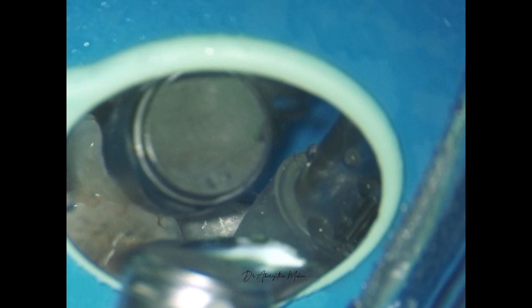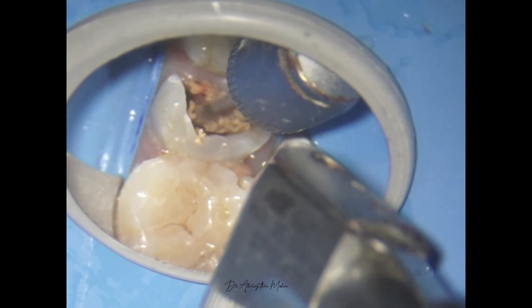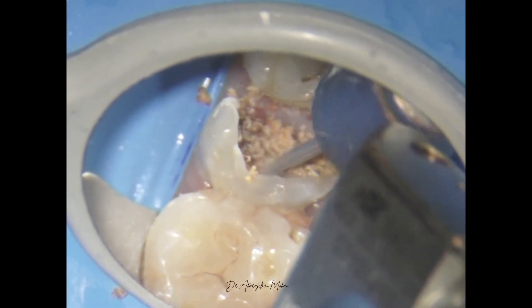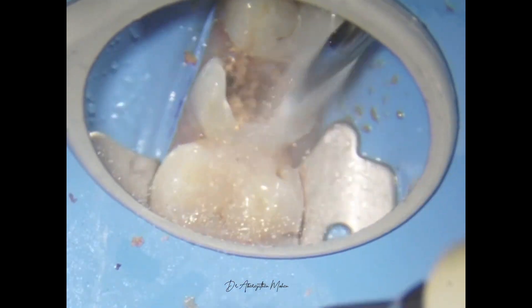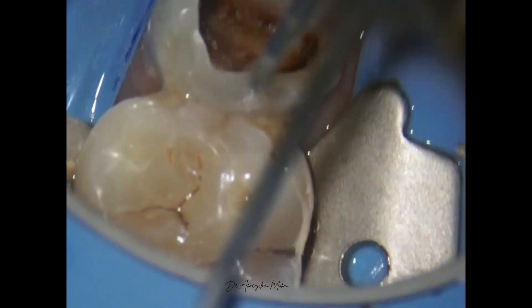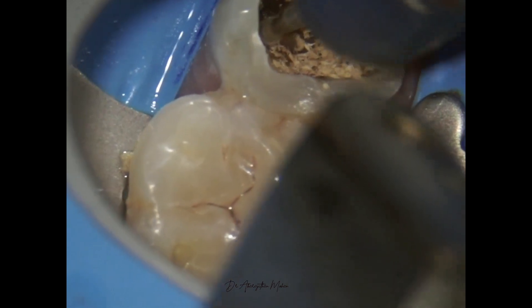I need to cut with much more control, so I will stop using the airotor high speed bur here as it is completely blocking my vision. You can see the use of long neck burs here — since the shaft is long, it does not obstruct my vision. Since it's used in slow speed, the speed range is between 5,000 to 20,000 RPM depending on what control you have. As I'm cutting the roof and clearing away the debris with a scaler to visualize where I am, you can see the entire procedure is done with utmost control.